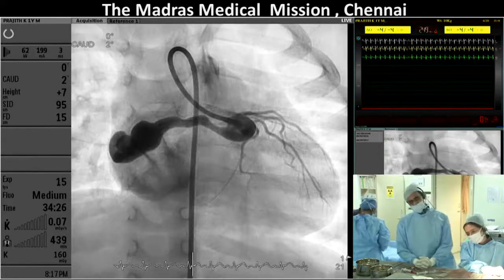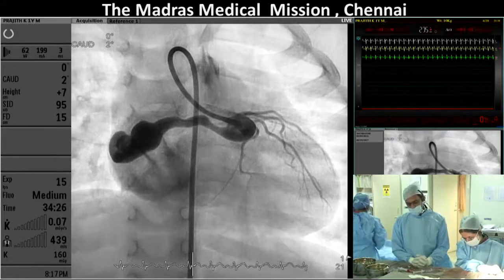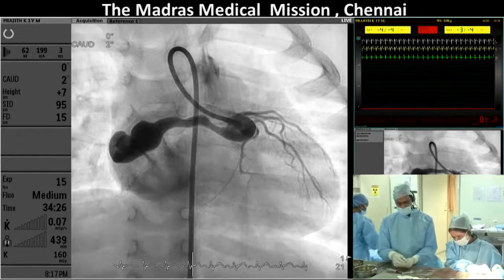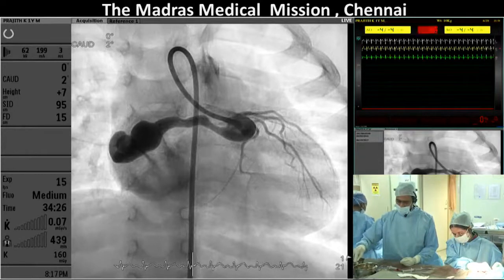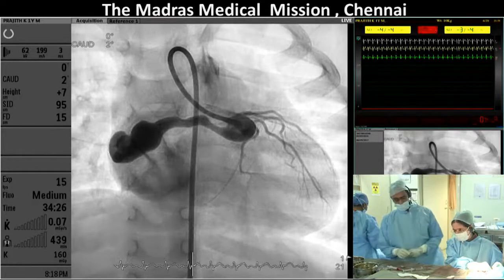So, Mansoor, I'm just curious, what on earth would possess you to send this patient for surgery? Okay, because on surgical, you will see the structures, and your ligations are going to be precise. Obviously now our shortcoming with catheters is that the precision is lost here. So throwing coils or putting a bigger device will jeopardize the flow of the sinoatrial artery.